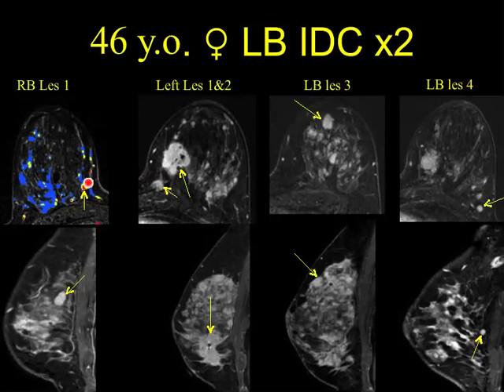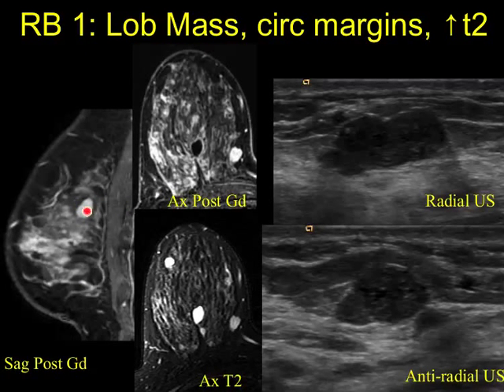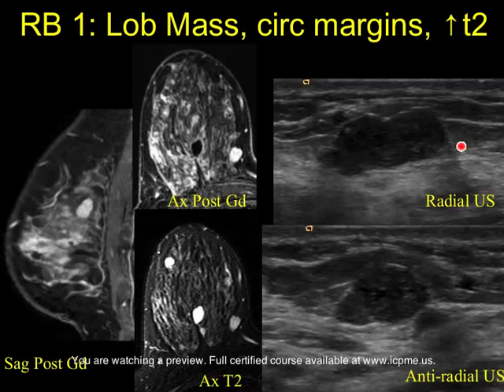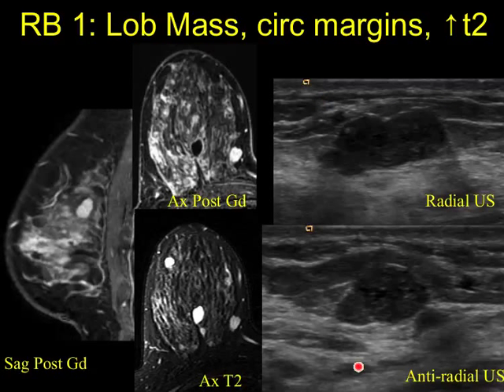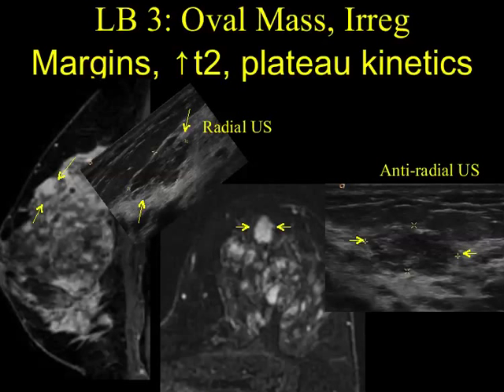Let's do our ultrasound correlation. Here's the MRI finding. I had a cyst to help me. Let's look at the shape of this mass and its superficial location as it impresses upon the subcutaneous fat. Here's our radial ultrasound showing that same lobular shape, same size correlate, and the margination with the superficial fat — an excellent correlation. The axial image doesn't correlate quite as well because anatomically the axial MR and the anti-radial ultrasound don't dovetail as well, but we can see surrounding fat density and the posterolateral breast tissue, which is a very good fit.